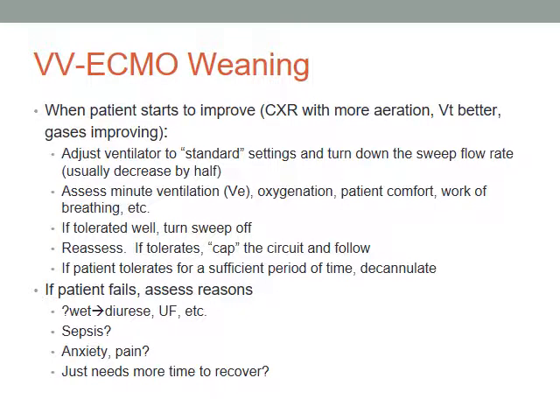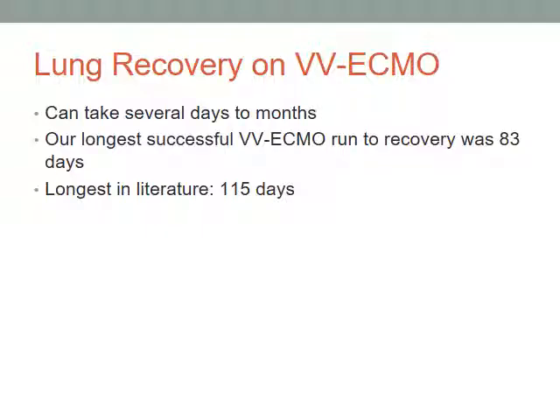Recovery can take days to months. Our longest successful VV ECMO was 83 days. The longest in the literature was 115. I am not disappointed that we did not make the record, although I thought we might. I thought that was a real possibility, but we got off at 83.